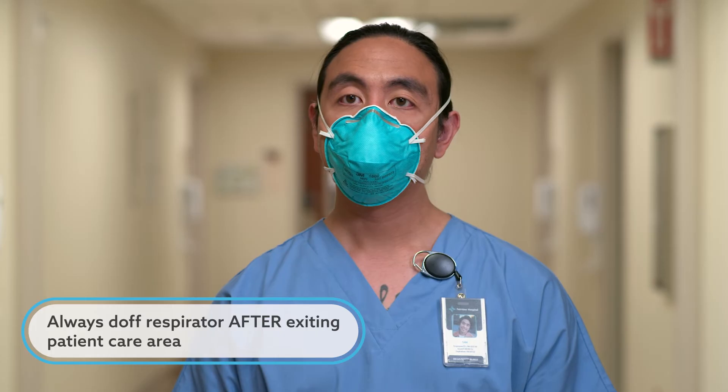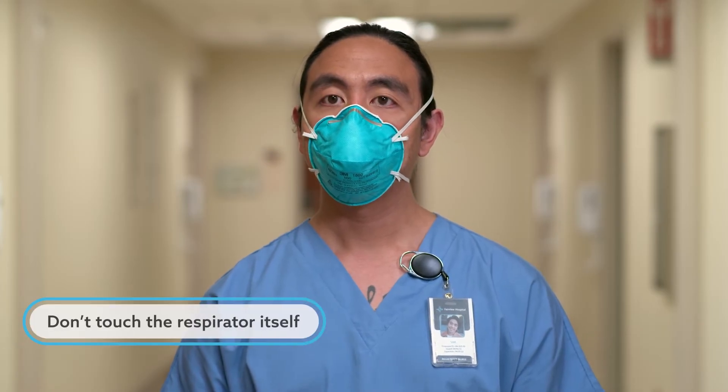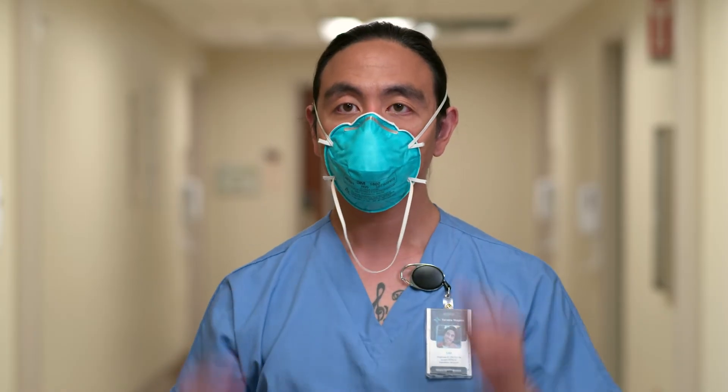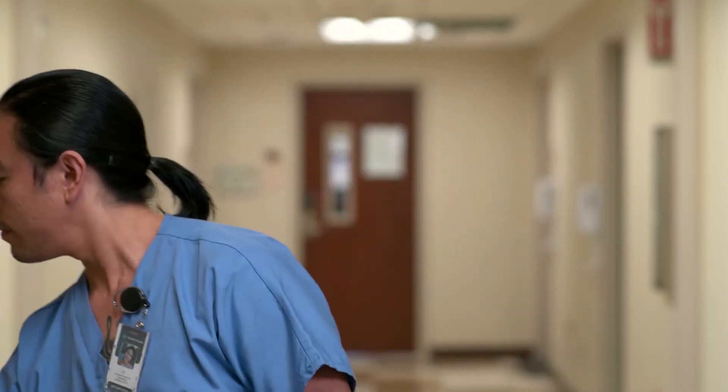Now let's go through the steps of doffing the respirator. Remember, a respirator is used if you have a patient on airborne precautions. Always remove a respirator after exiting the patient's room, and always perform hand hygiene upon exiting. Remember, the front of the respirator is contaminated, so without touching the respirator, pull the bottom strap over the back of the head. Then pull the top strap over the head. Discard in the waste container. The last step is to perform hand hygiene after doffing the respirator.